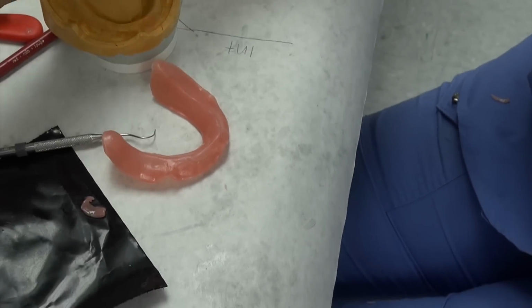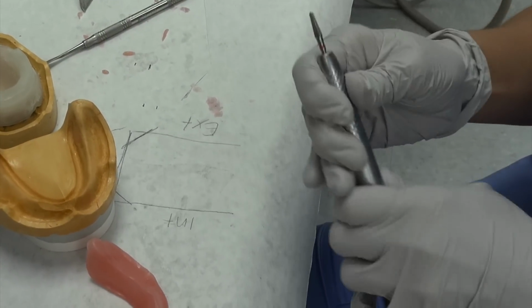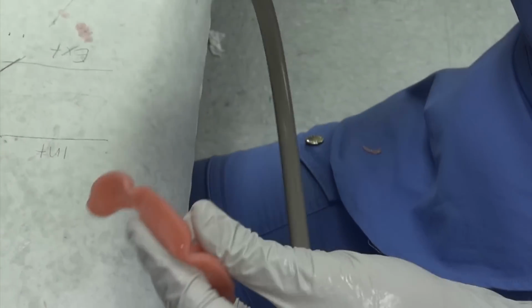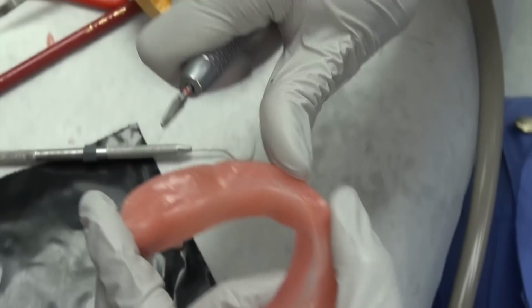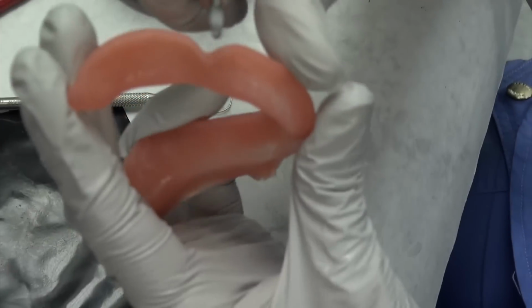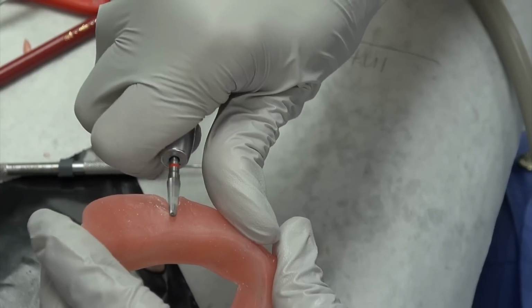Now the very last thing that we're going to show you is you want your frenula to be slightly thinned and short rolled borders. Okay, so look at the exact terminology of your grading. It's very, very important. Okay, so I'm just gonna roll in here. Okay, so you see how I'm rolling those borders? Okay, and now I'm gonna smooth it out, thin it up a bit.